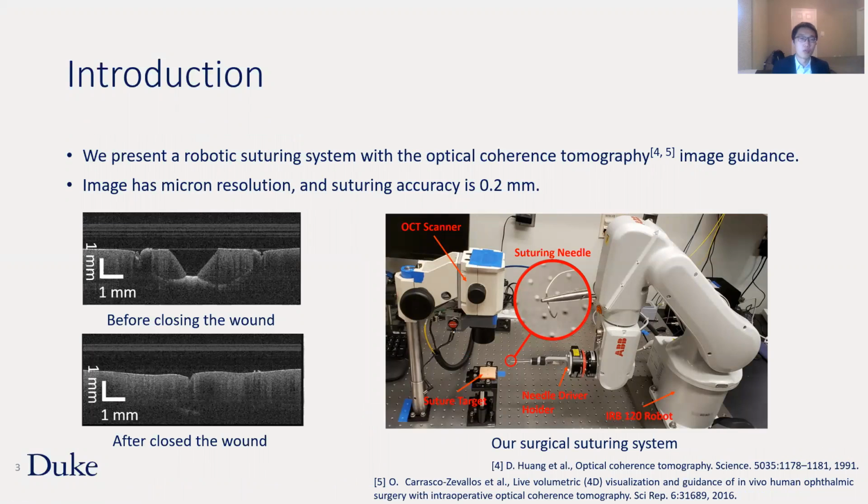We present a robotic suturing system with the guidance of optical coherence tomography, OCT. OCT is a laser-based imaging technology. It can generate a cross-sectional view of biological tissue. We call this a B-scan. With several B-scans, we can generate a 3D OCT volume of the biological tissue. OCT has micron resolution. With OCT, our suturing accuracy is 0.2 millimeter. In the right image, this is our surgical suturing system setting.